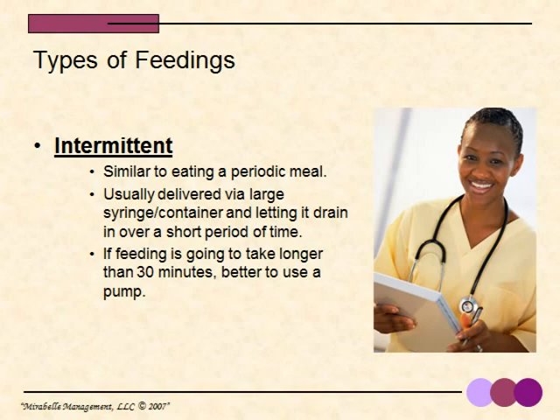If the feeding is going to take longer than about 30 minutes, the client may find it more beneficial to use a pump that can control the rate of delivery and allow the person or the caregiver the opportunity to do other things during the delivery.